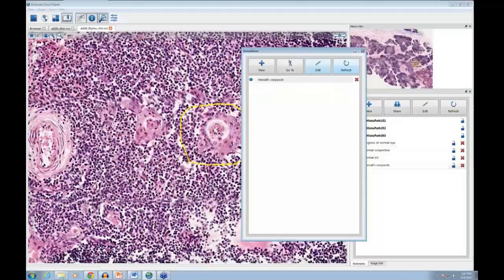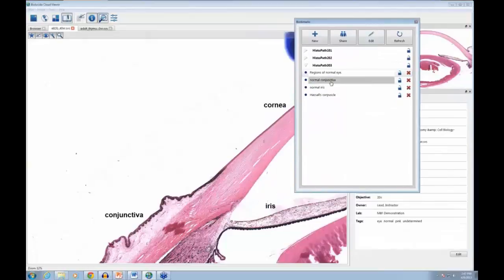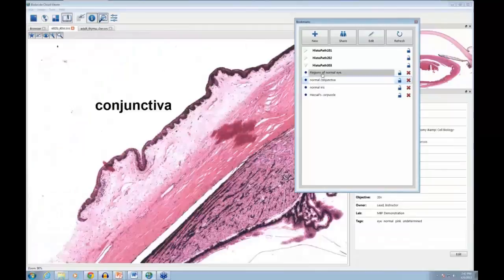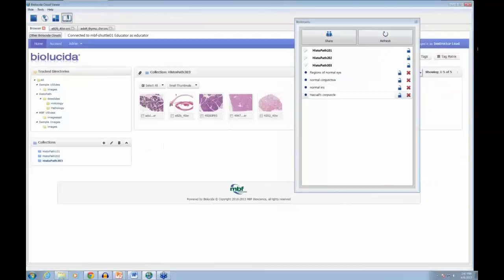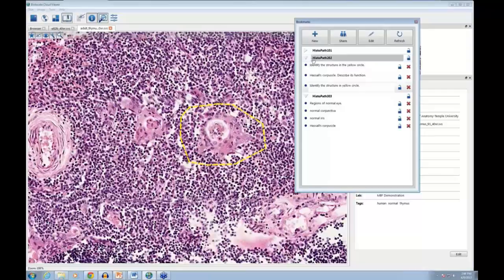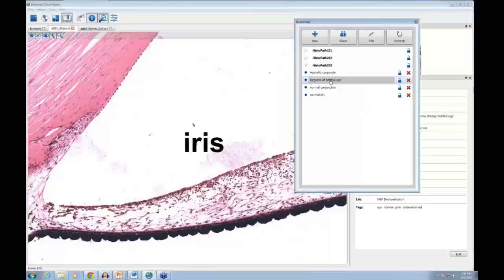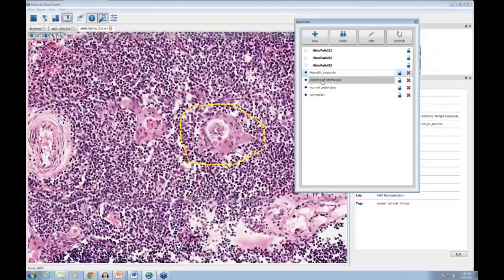With that done, I have my annotation and it also appears in my bookmark list. I can step through these different regions from all the slides in this collection. I can see bookmarks from all my histopath collections organized together. You can also rearrange the order — for instance, moving Hassall's Corpuscle to the top of the list before the eye annotations.